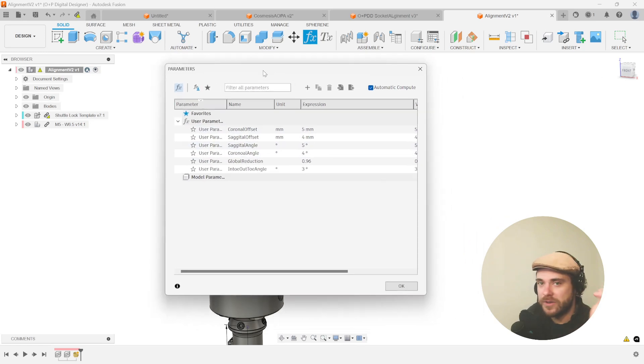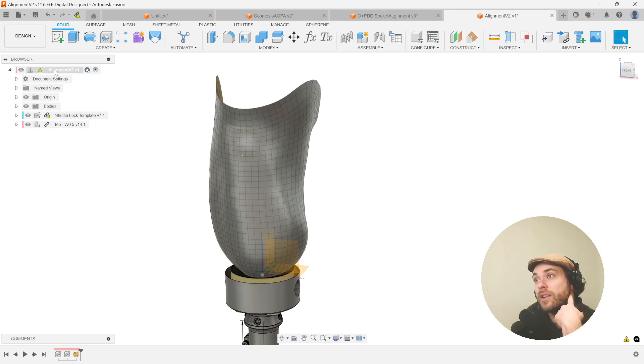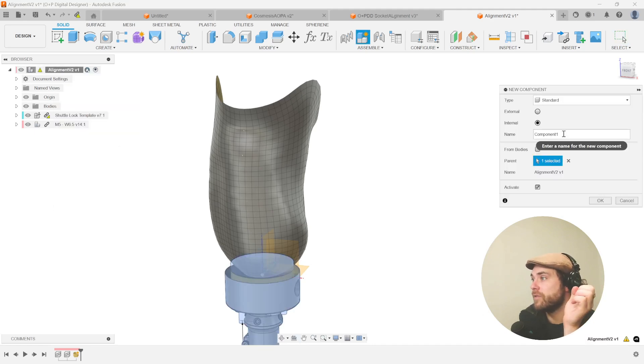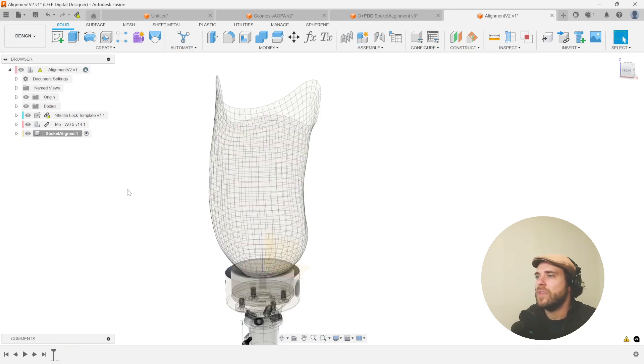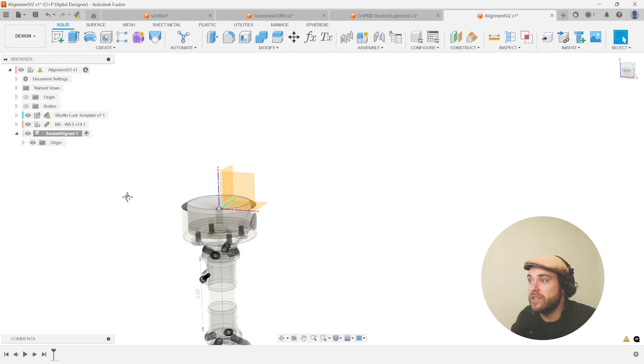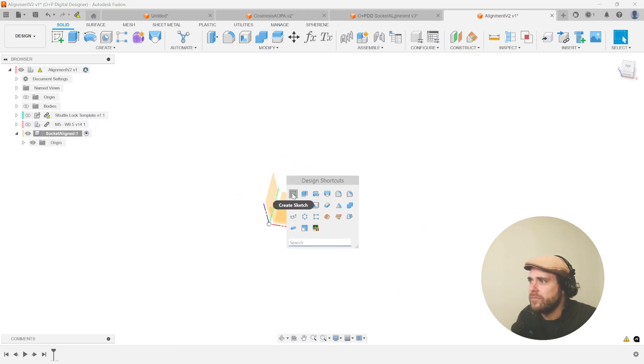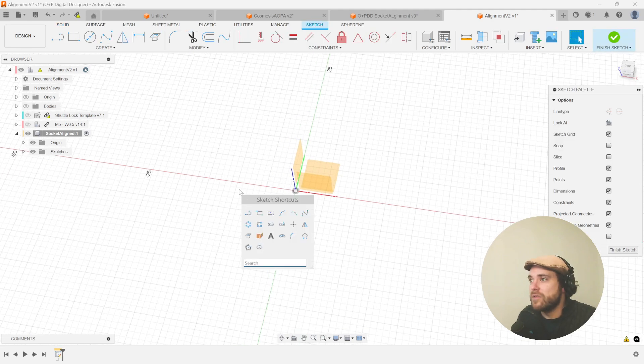We'll be able to call upon these as we now start to build out the smart sketch, which will give us those handles of control. Closing our parameters window, we have a bunch of user-based parameters ready. Let's create our alignment within a new component — my favorite first step of any workflow. We'll call this something like 'socket alignment.' In this new component, let's turn on the origin, turn off the root origin, hide the bodies, and create a new sketch on the top plane.